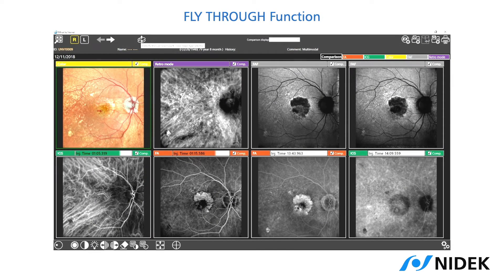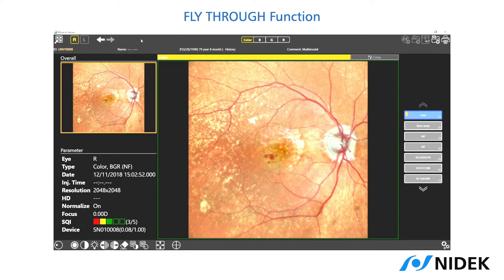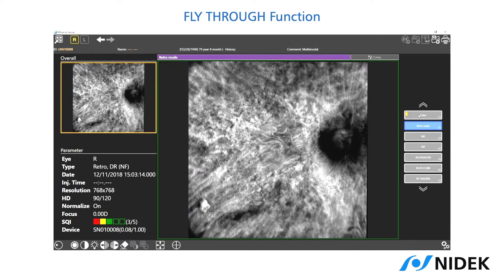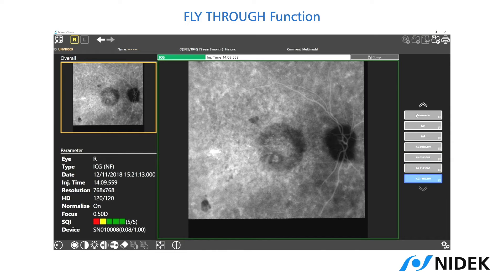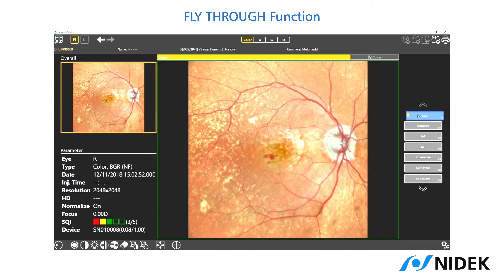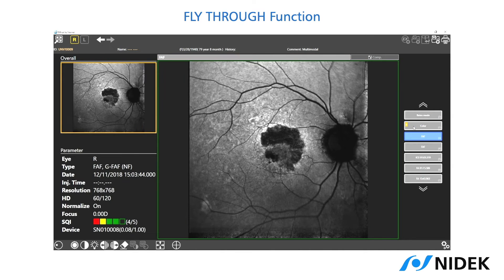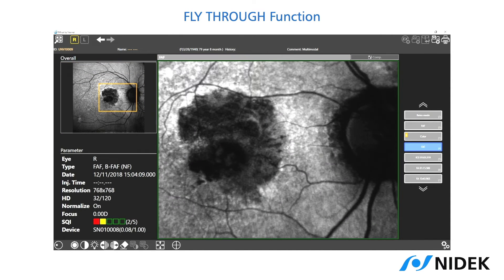When it comes to reviewing the SLO images, you can take advantage of the fly-through function. The fly-through function puts in one-to-one anatomical correspondence a larger set of images coming from the same fundus taken in different modalities by stacking them up while registering them. This allows you to scroll through this stack of images and see easily what the same anatomical point looks like in the various modalities, ensuring maximum accuracy for your diagnosis.